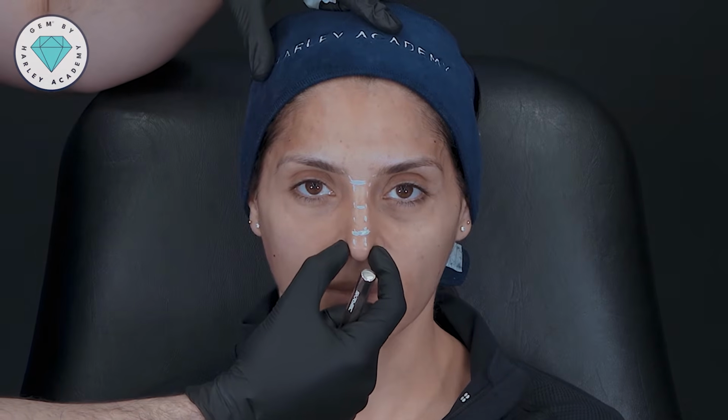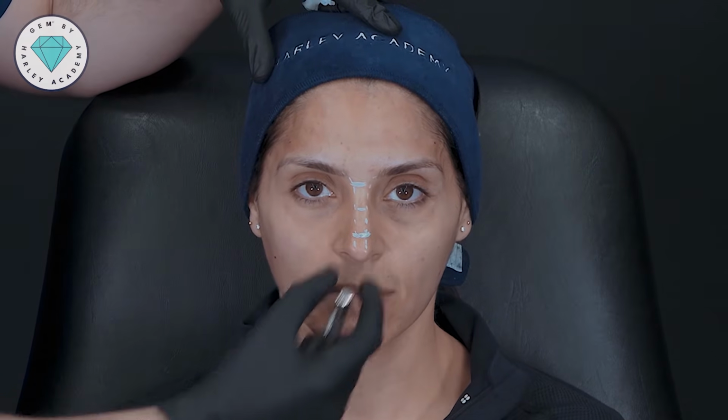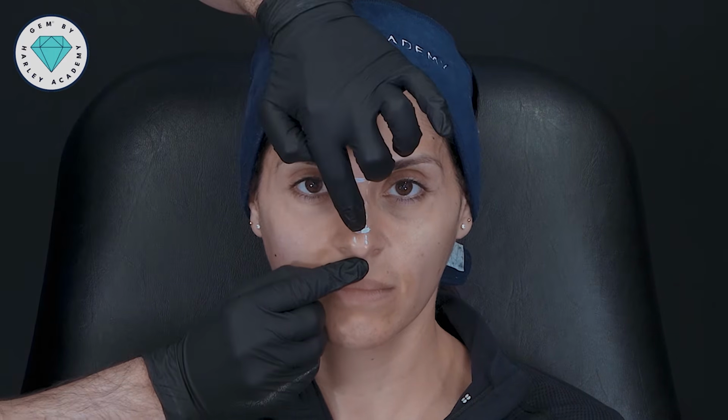I'm going to sit you forwards just a little bit. Thank you. And so all of this area, we have no depth control, and that means that we can't reliably say where the blood vessels ought to be. So we have to be very careful in this tip of the nose.